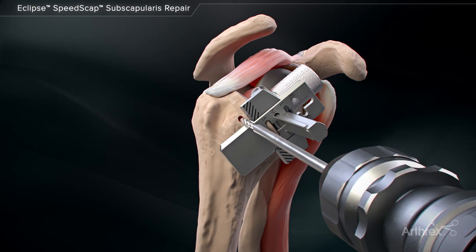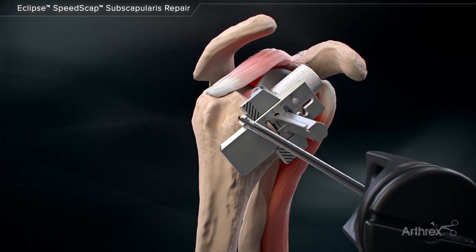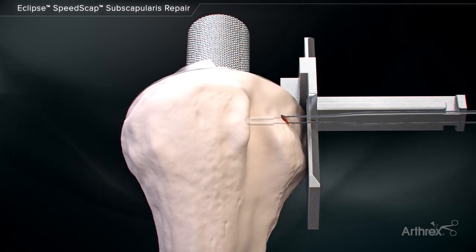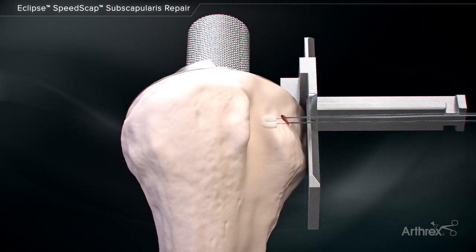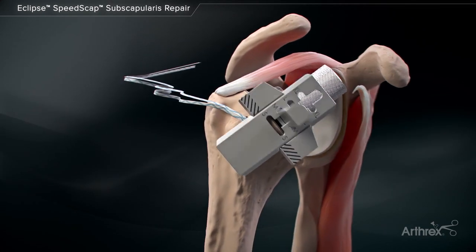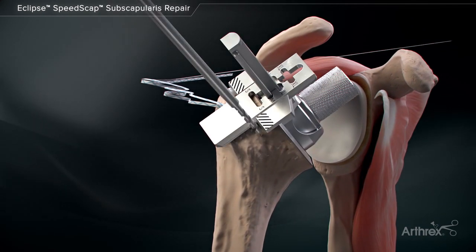The medial row of the repair is completed by placing three FibreTac DR anchors in the appropriate position to maximize native subscapularis footprint contact on the lesser tuberosity. The trunnion adapter can be rotated as needed to optimize anchor position and avoid the cage screw.